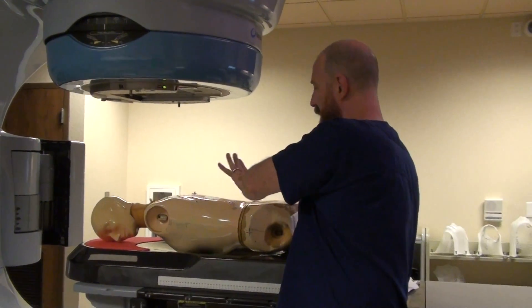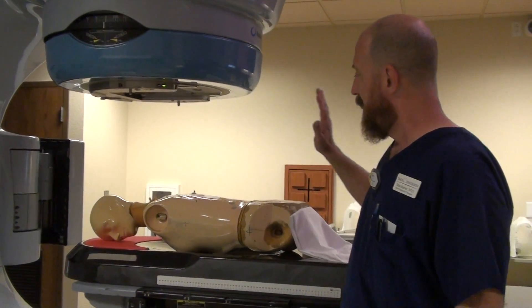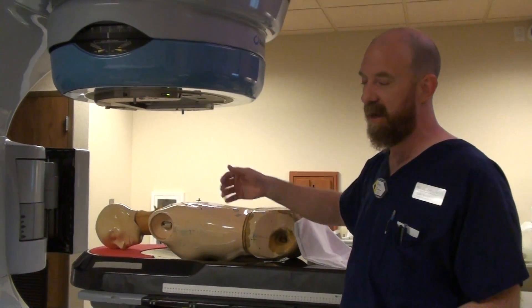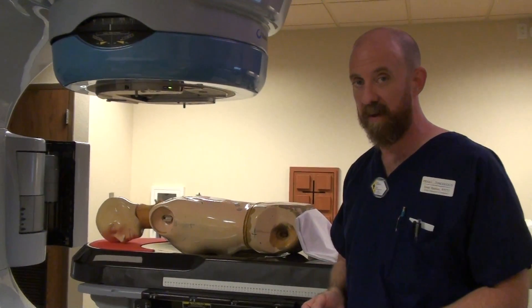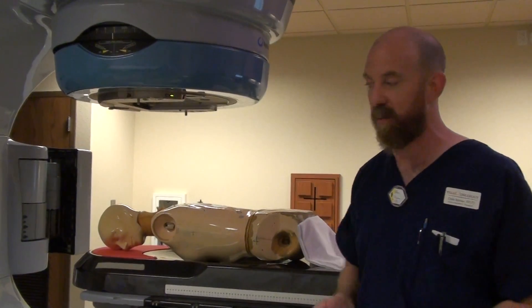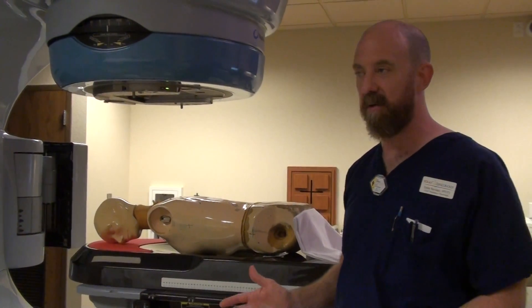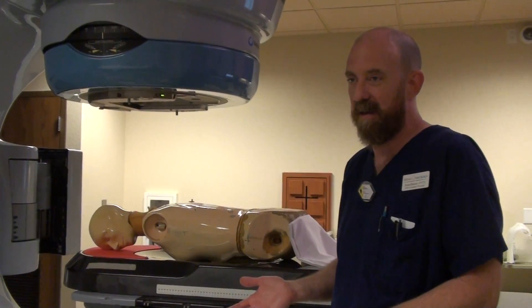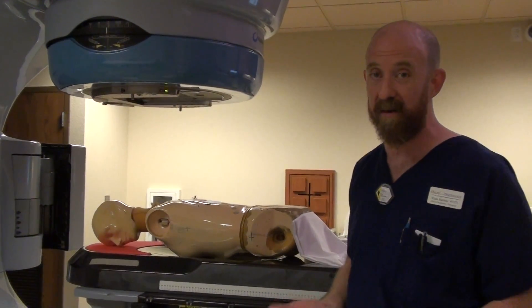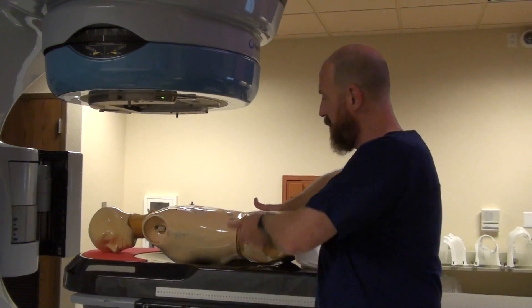If you're coming towards you, grab the sheet on the other side, hand open, roll. Gentlemen especially — if you've got a female face down, or once we get to breast setups a female face up, you want to be very delicate and very careful. You don't want there to be any misunderstandings; be as professional as possible. If you do roll this patient, make sure your hand is open and make sure everyone in the room, including yourself, knows that you're not going to do anything by accident that is going to cause the patient to be even more uncomfortable than they already are. Hand open, high up, almost to the hip, roll.